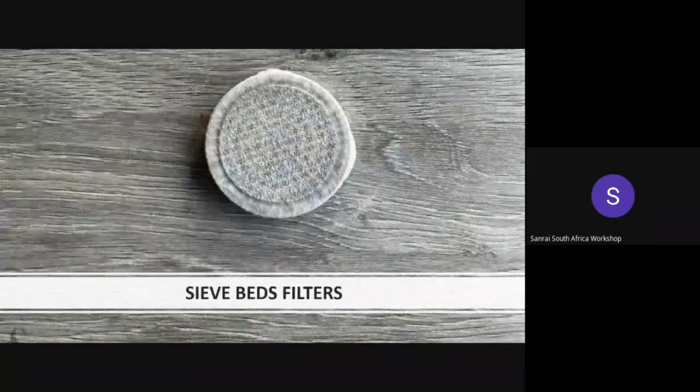Okay, so next we have the sieve bed filters. These are the filters that filter the air that comes into the sieve tanks to prevent any particles from entering and contaminating the zeolite. When these filters are clogged, they affect the purity of the machine. When refilling the sieve beds, you will need to check these filters.